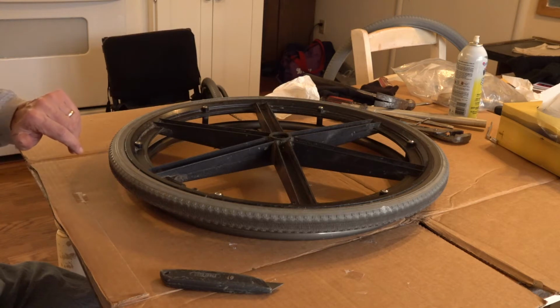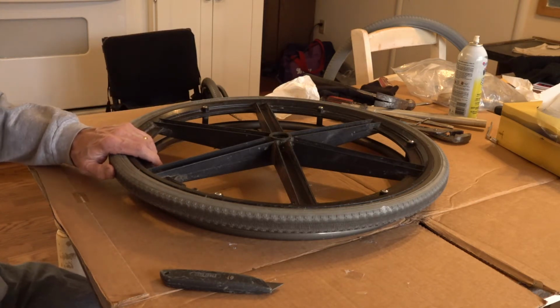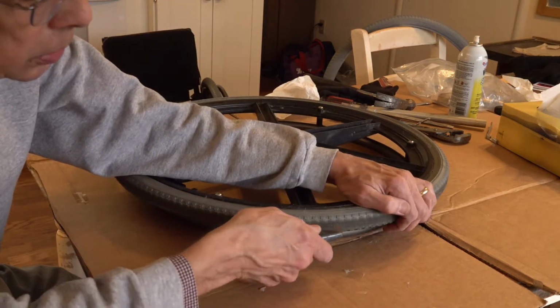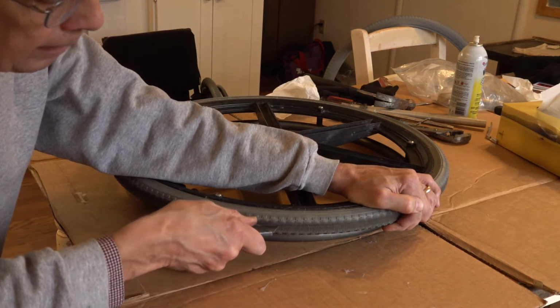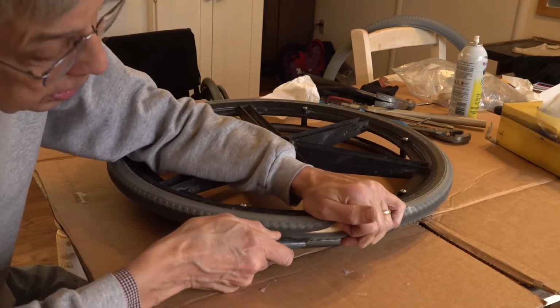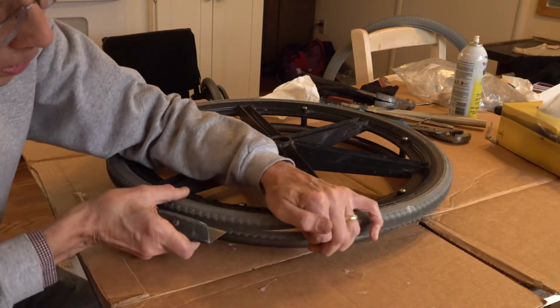The first trick is to get the old tire off without damaging the rim. The trick to do that is just simply to cut down the middle of the old tire like this, so you can separate it and see the insert in there. And so we go completely around.